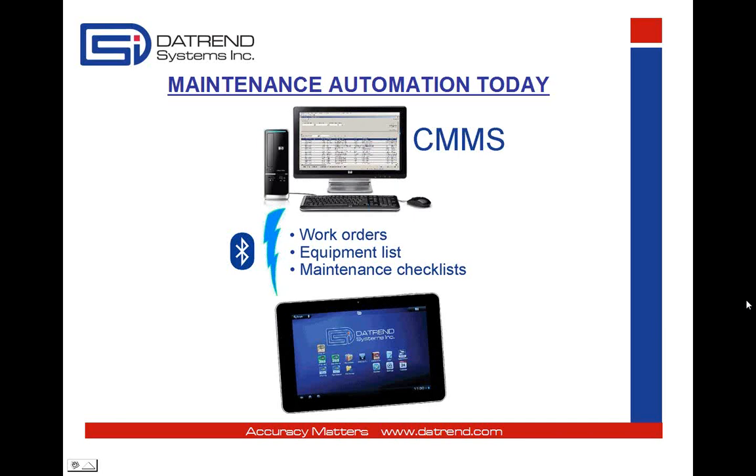Your CMMS is running on a workstation. In the CMMS, you've got your equipment and your schedule, as usual. Also, you've got your checklist procedures, which are linked to particular control numbers and maybe work order numbers. As you might do for a med tester, you prepare the information to be exported. But instead of a med tester, you export that same data to a tablet. And as shown here, it can be done using Bluetooth, pushing work orders, equipment, and procedures from your workstation onto the tablet.